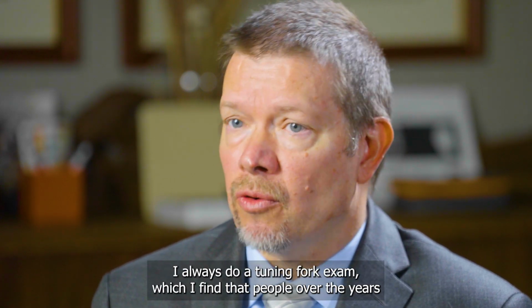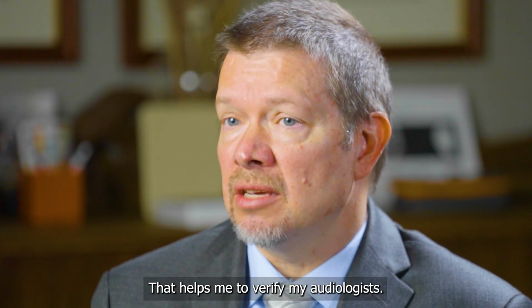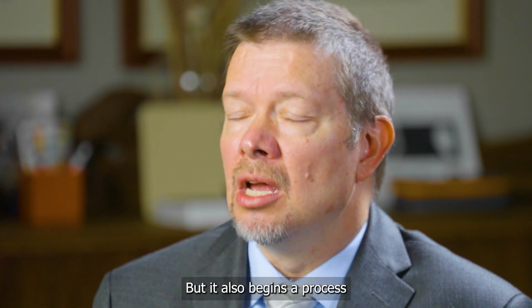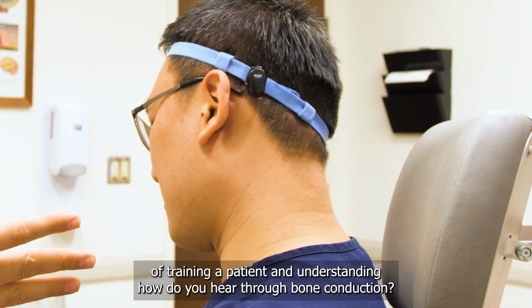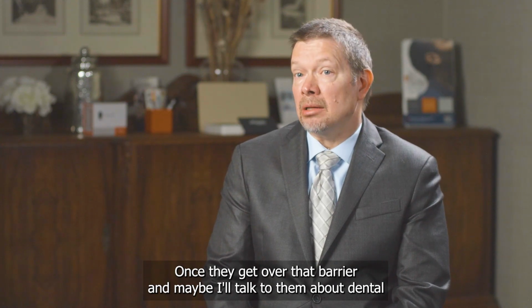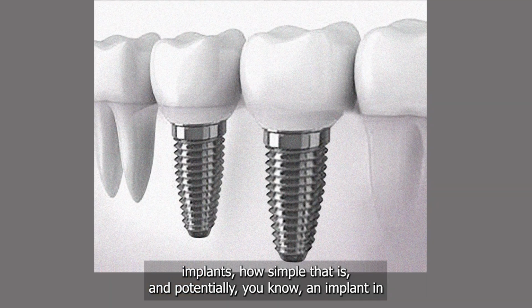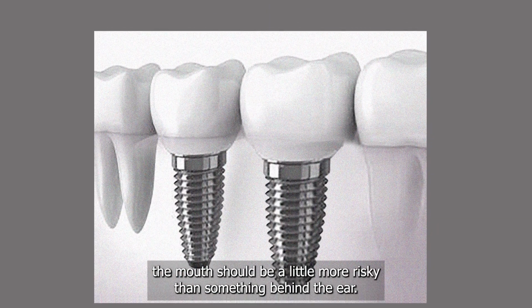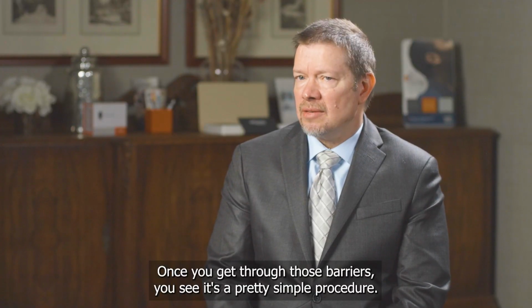I always do a tuning fork exam, which I find that people over the years stop doing. That helps me to verify my audiologist, but it also begins a process of training a patient and understanding how do you hear through bone conduction. Once they get over that barrier, maybe I'll talk to them about dental implants, how simple that is, and potentially, an implant in the mouth should be a little more risky than something behind the ear. Once you get through those barriers, you see it's a pretty simple procedure.